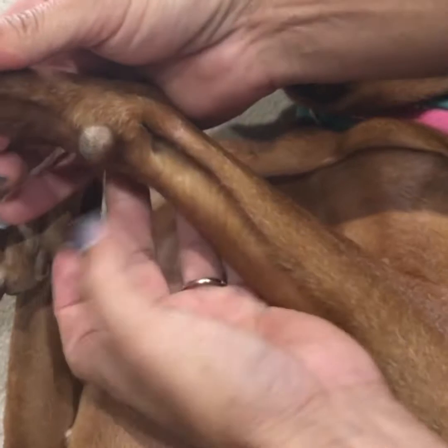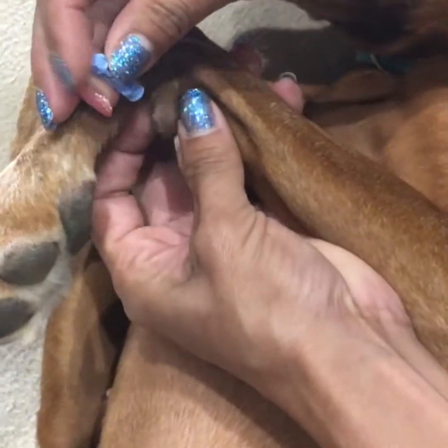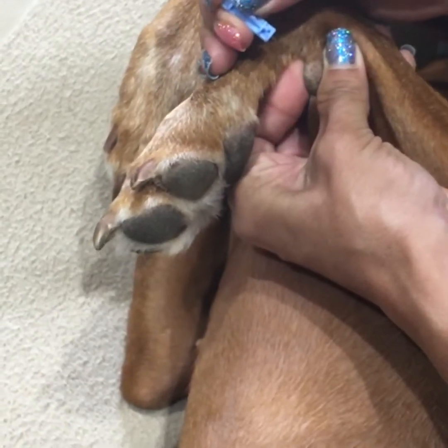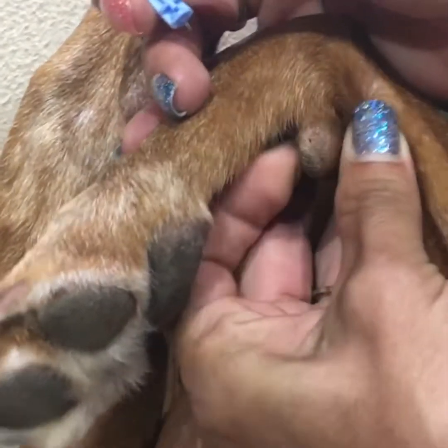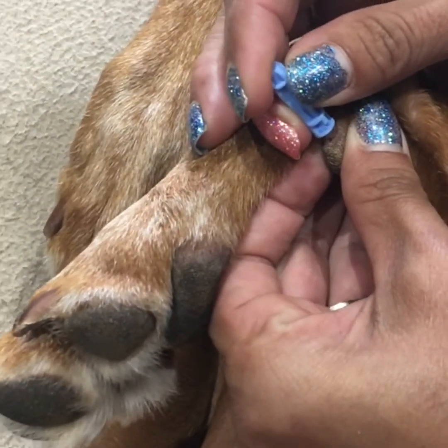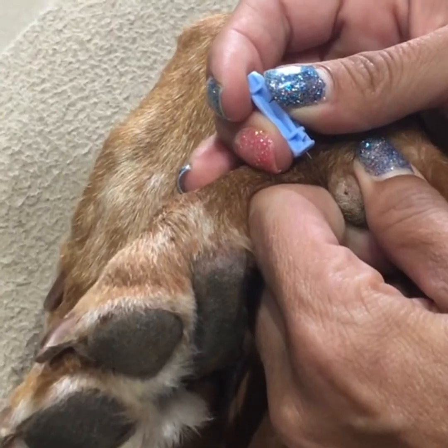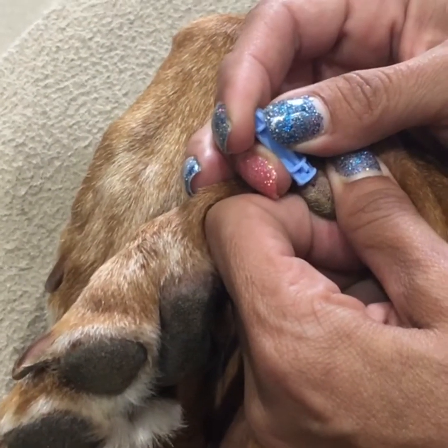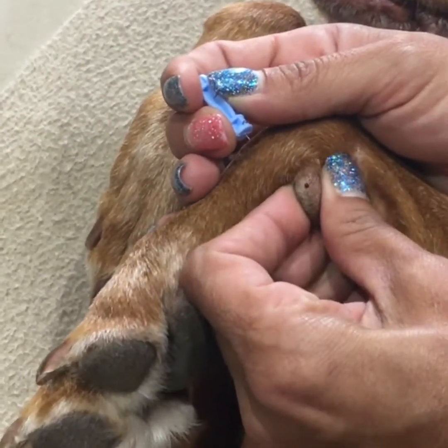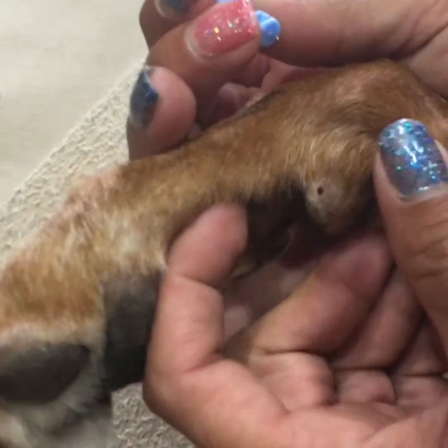I like to poke this pad up here that they don't use very much. Let's see if she'll hold still — just a quick poke. She's not wanting to bleed very well. You can do an additional poke or just a scratch on the surface, and sometimes that's enough. If you can't get blood from that pad, you look for another spot — and there, I got enough blood.